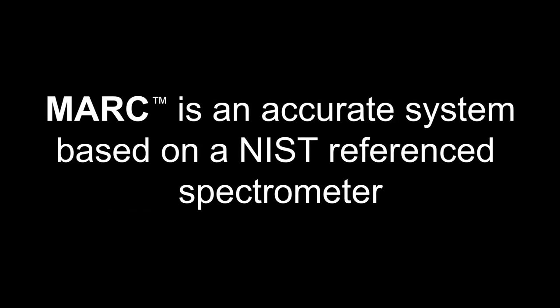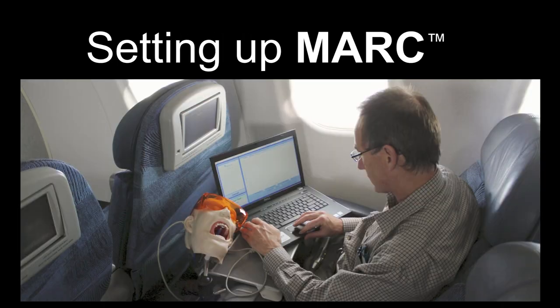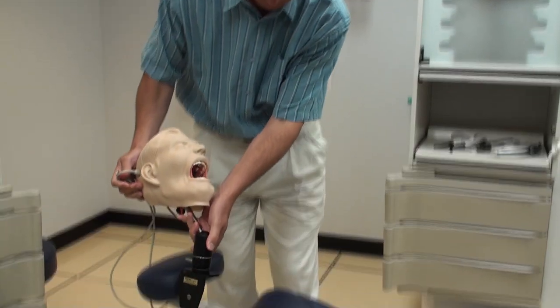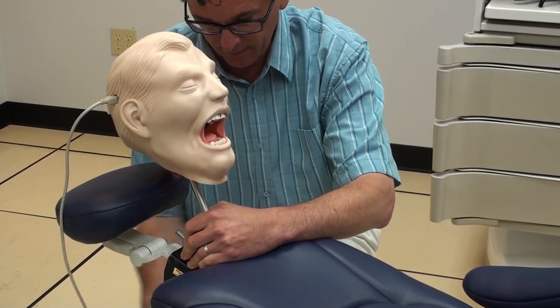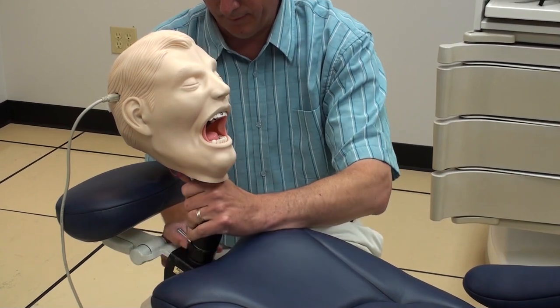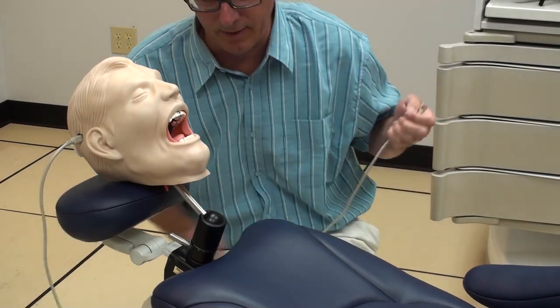Mark is an accurate system based on a National Institute of Standards Technology referenced spectrometer. Here we can see the sensors in Mark. The sensors are roughly the same size as a Class I preparation in a bicuspid tooth. The Mark head is easy to set up and the software is very user friendly. Mark can be used almost anywhere — here we can see it being attached to a dental chair or a laboratory bench. The USB cable is then plugged into the computer which runs the proprietary Mark software.